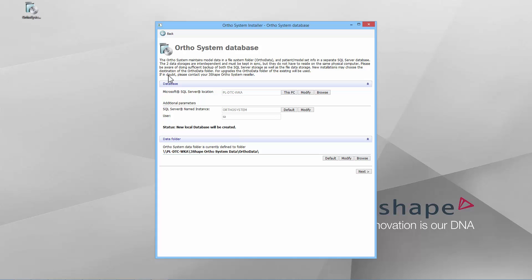Comparing to the standalone installation, the default SQL Server location will be set to the PC name instead of the local host. And the OrthoData path will be a UNC path instead of a local path. Both the SQL Server location and OrthoData can be remote. Click Next to proceed.